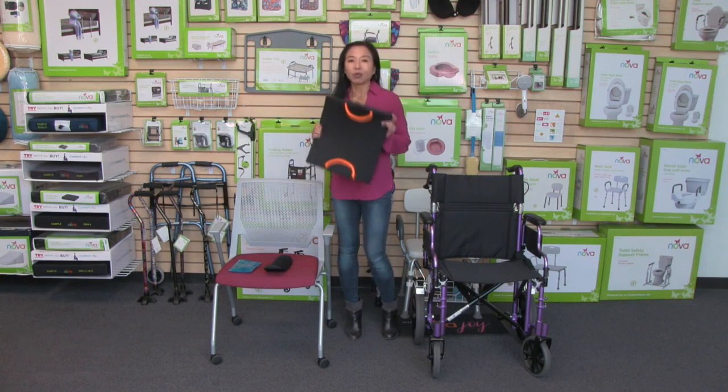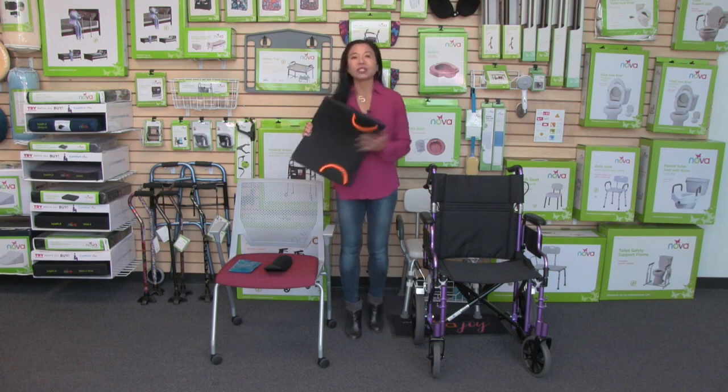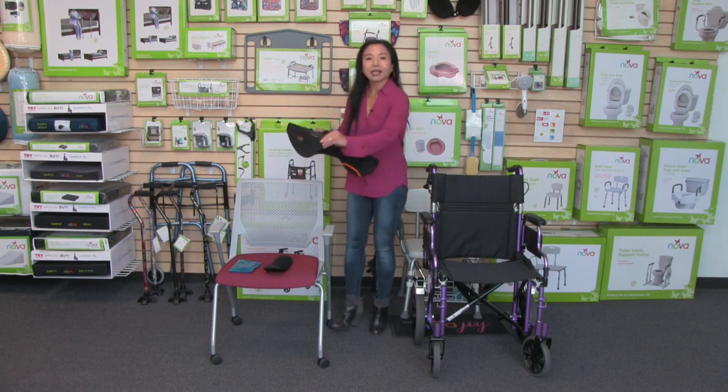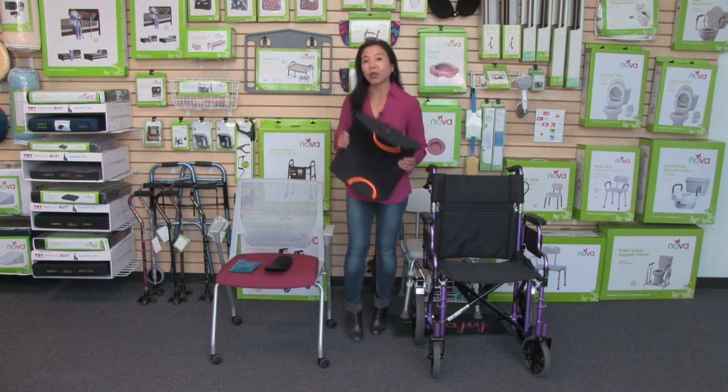It starts with having a great cover. This cover is so soft, but it's also very breathable. It's got a zipper here, so it's removable and washable.